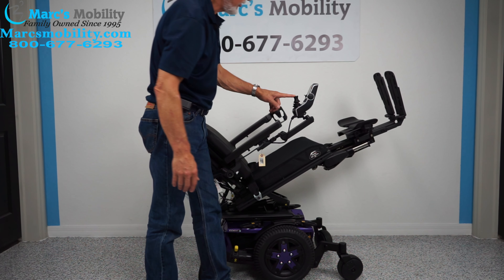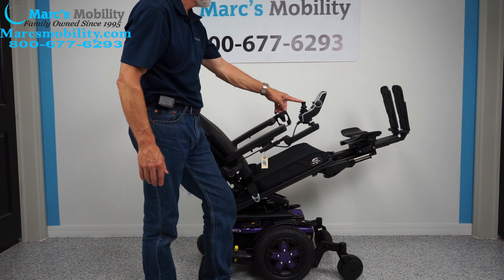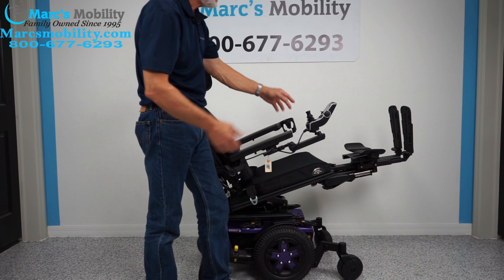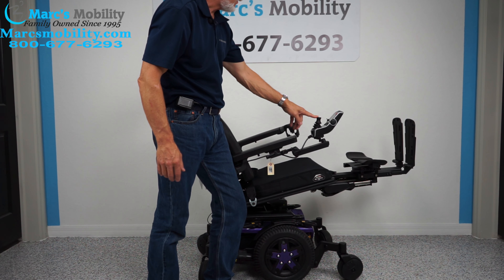I'm going to bring the tilt back down a little bit to show you — even if you're halfway tilted, right about here, it's still pretty decent. So I'm going to bring it all the way down.